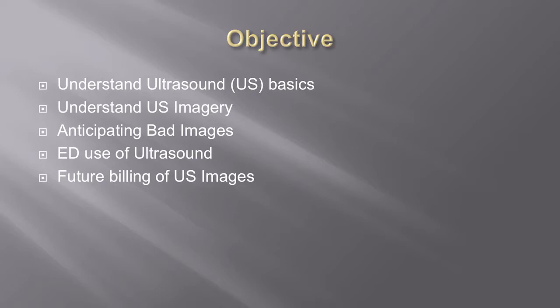So ultrasound basically is an image just generated by an interpretation of a sound wave, okay? The military actually is what designed the ultrasound machine for us back in the day. Back in World War I and II, when we started getting bombed with submarines, we had to find a way to detect submarines moving on the water. That's where the ultrasound comes from.